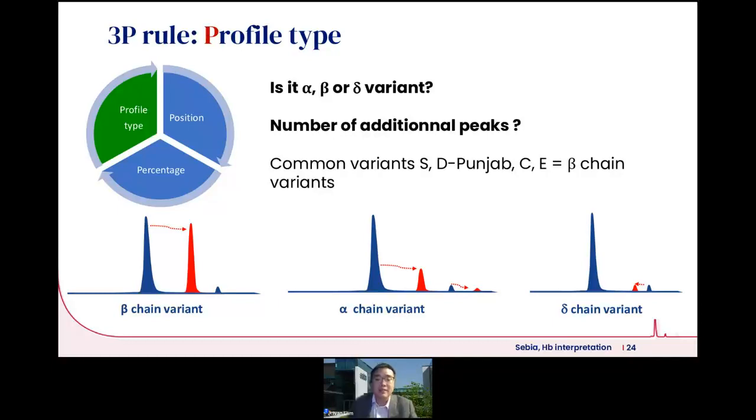Because the alpha chains are present in four copies, the splitting is not as big as that of the beta chain splitting. So you see a splitting with a smaller fraction, but it happens in an equidistant manner to all hemoglobins. Why? Because the change in the alpha chain is the same for all hemoglobins. In the instance of the delta chain variant, you see a little splitting of the hemoglobin A2, and we call that the A2 value a combination of both fractions.